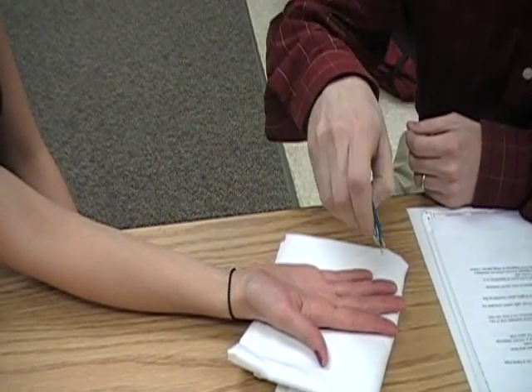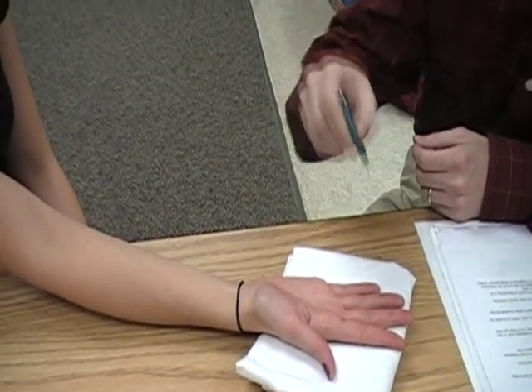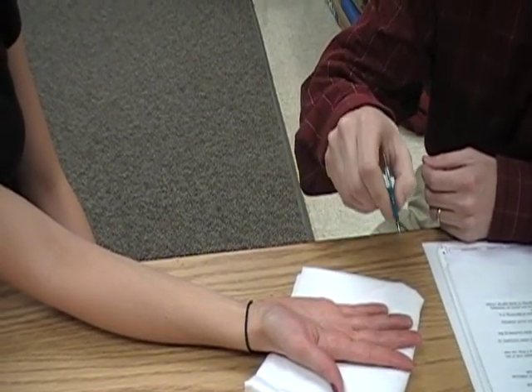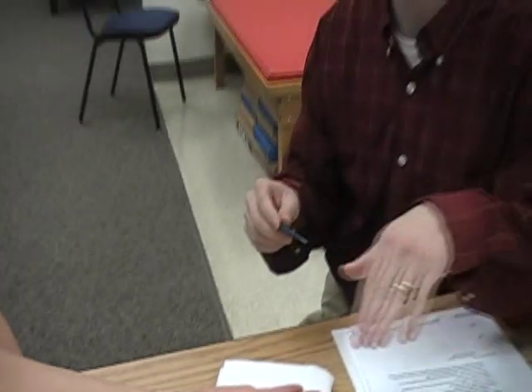Elizabeth responds: two points, then one, then one. Now we know that she can feel five millimeters, so we will move to four. You would keep her positioned the same way throughout the test.